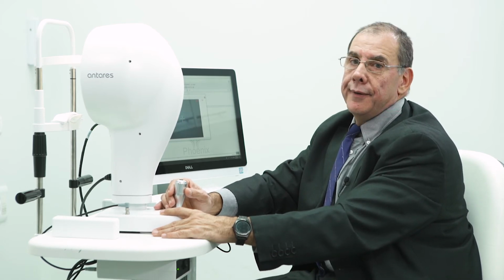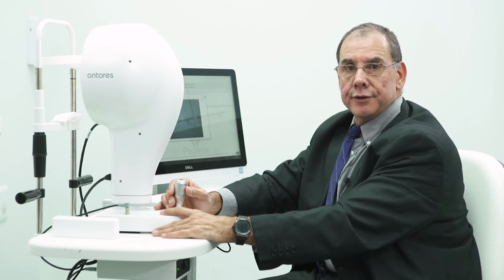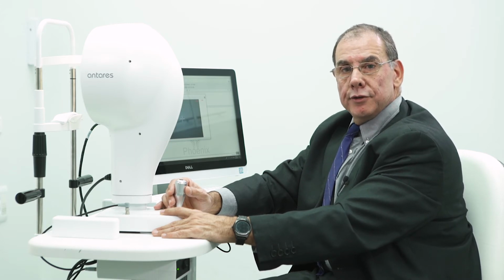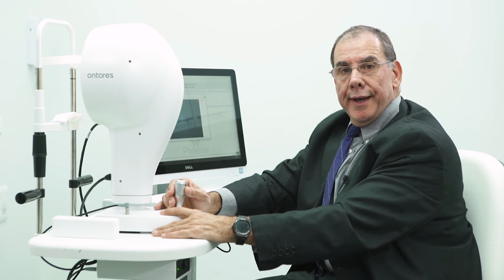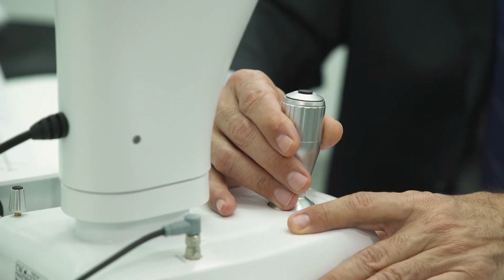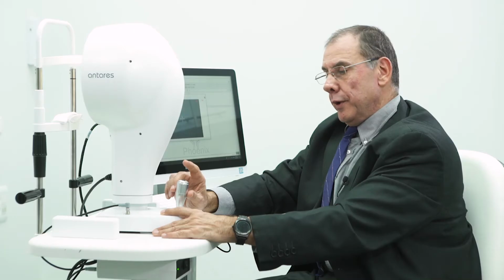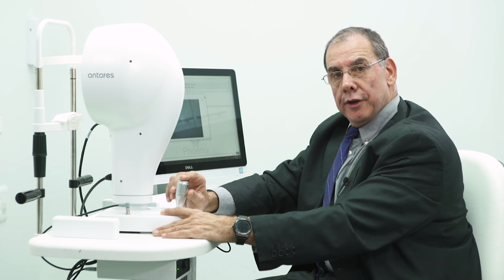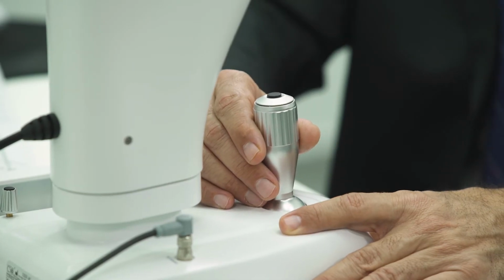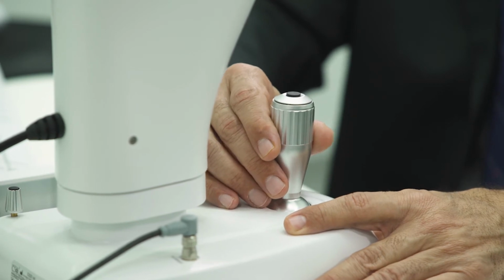We're going to get a reflex off the cornea, a little dot, and we're going to have a centering cross. Our task will be to align these two together, so that the dot is in the center of the cross. Then we're going to bring the actual topographer slightly back out of focus. We're going to click once on the joystick, and then we're going to move forward. And we're going to try and move forward without going sideways.